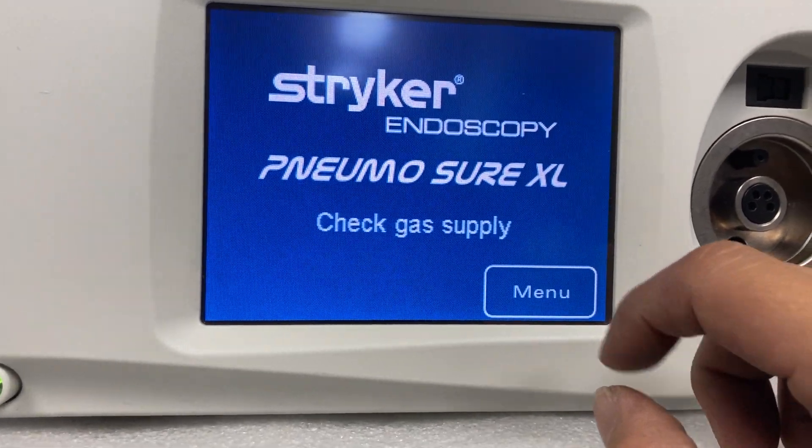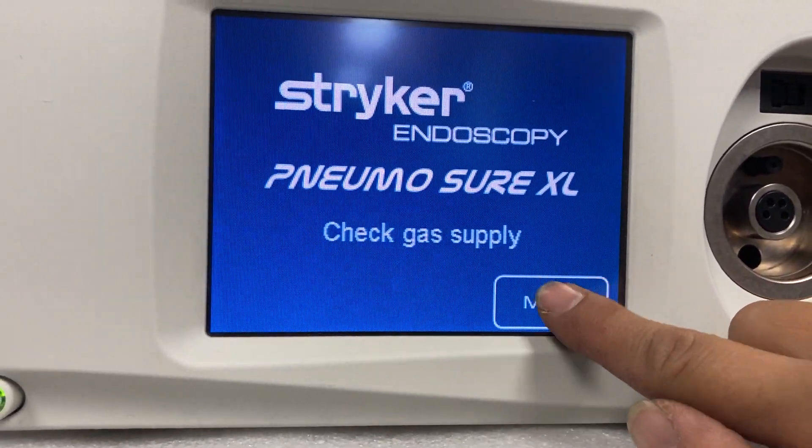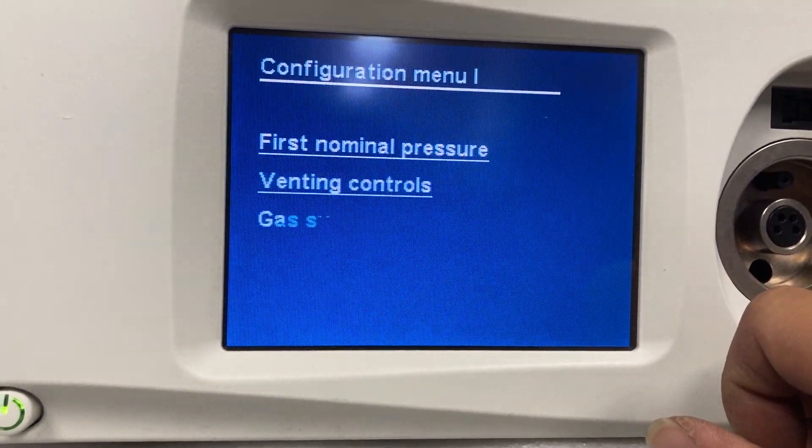Next screen. Back to the menu again. Now it's working.